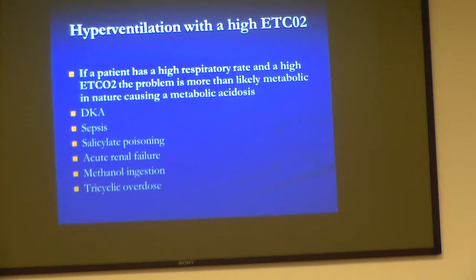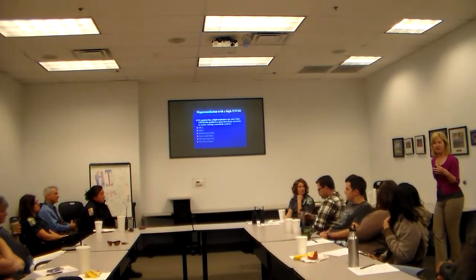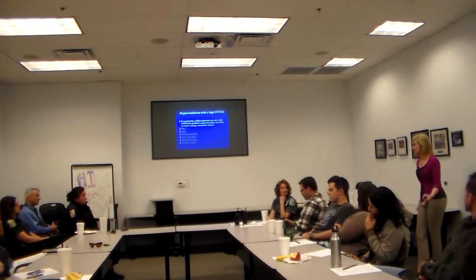They're hyperventilating because they're trying to blow off all that CO2, but they have a high end-tidal. Many times it's because they're in DKA, those patients that are breathing really rapidly because they're acidotic, trying to blow off all the CO2. The septic patient, you may see them come in. Dr. Lum just did a whole case presentation on a patient that was septic, who had necrotizing fasciitis. He came in with a super high respiratory rate. We thought he had an aspirin overdose because he was breathing at like 45, 50 a minute, and he'd been taking a lot of aspirin for the last few days. Turns out that was not his problem.